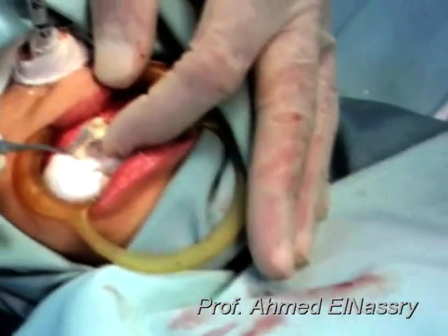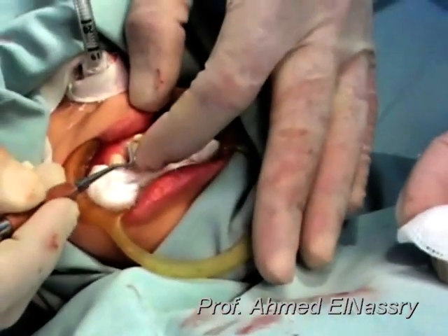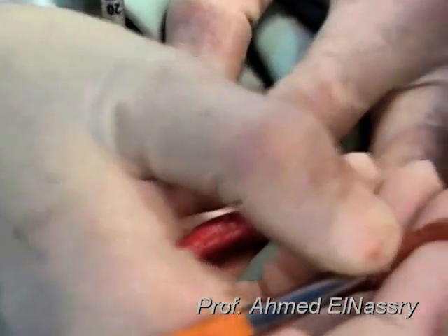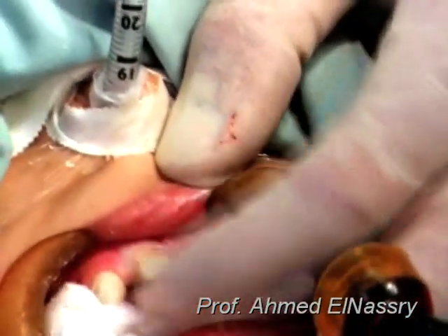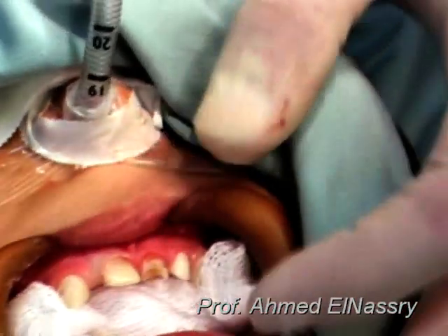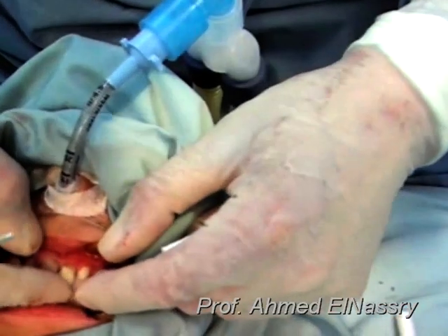Removal of the excess of the composite. Cure the composite.